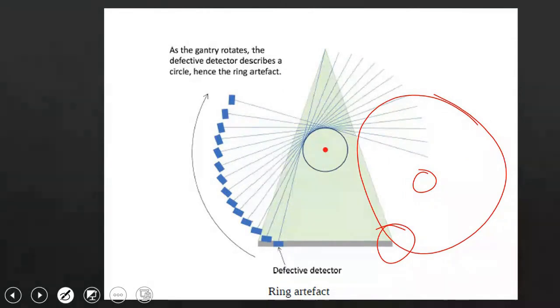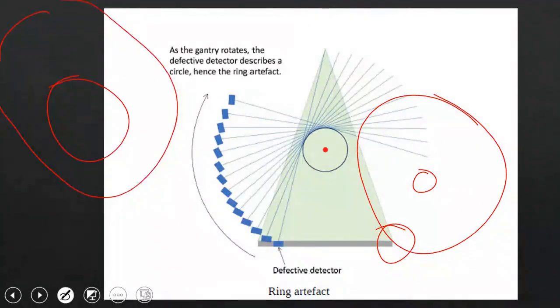It makes the field of view in your image show that there is no ring artifact. The ring artifact appears far outside the field of view in the black area that you can't see. So, they tell you that some companies do this to deceive the owners of the centers, especially if the device is still under warranty. So they don't have to change the detector or do any repairs, avoiding the need to get spare parts or replacements.